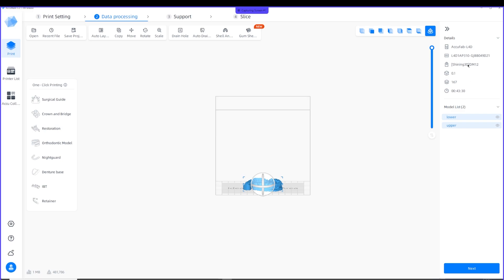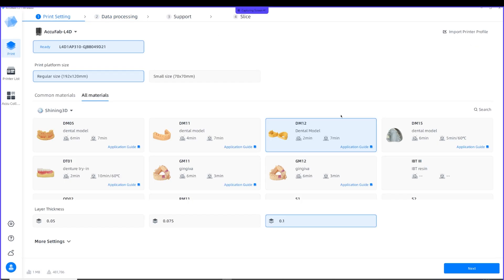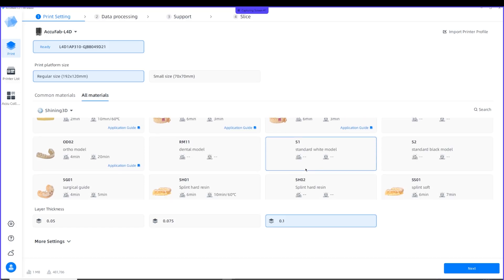Now, if you look in your details here, if this doesn't match the model resin you've actually chosen for your printer, then click back to Print Settings and choose the model resin you're using.